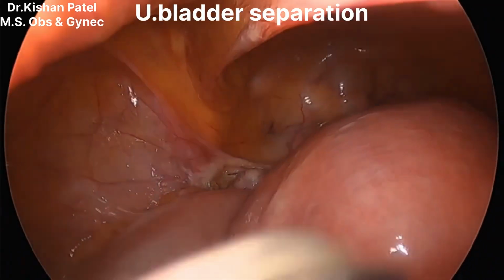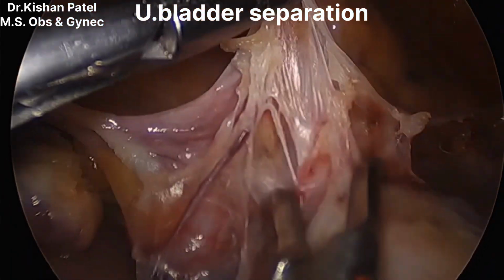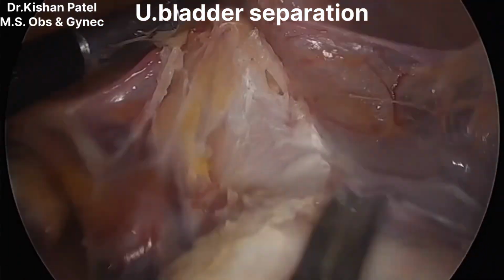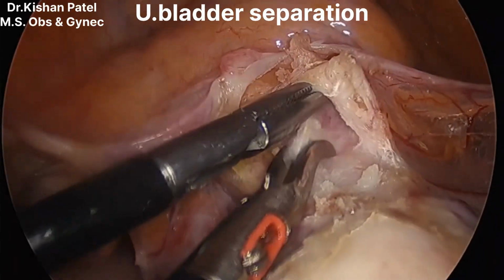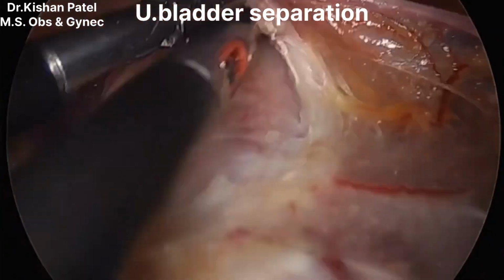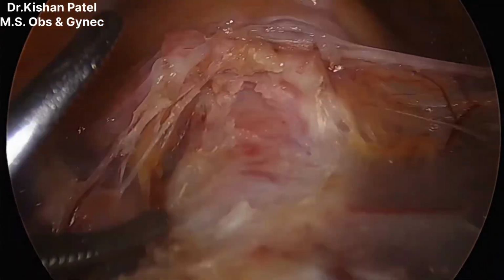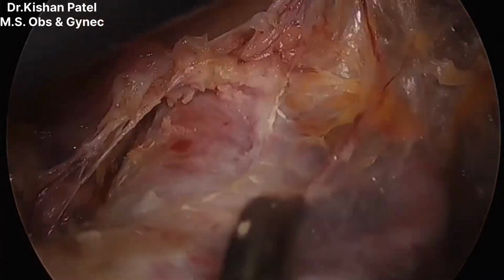Now we will do the most important step of the TLH, separating the bladder from the uterus. We are separating the bladder from the uterus. As you can see, we are doing central dissection. We have separated the bladder. Now we will separate the bladder pillars.